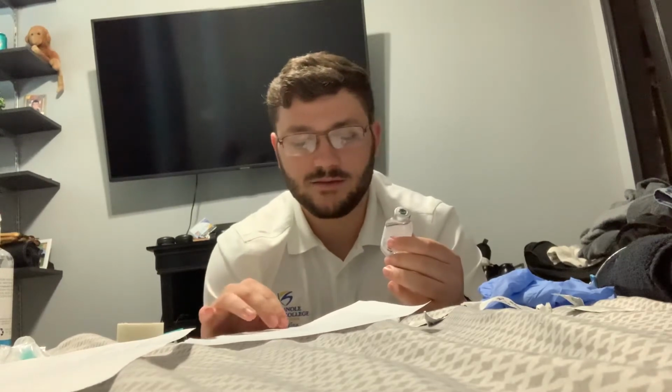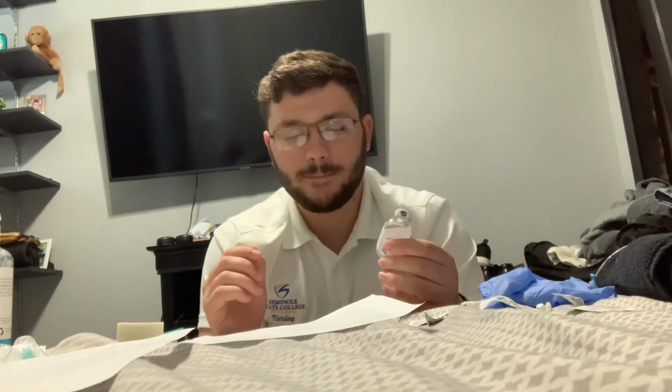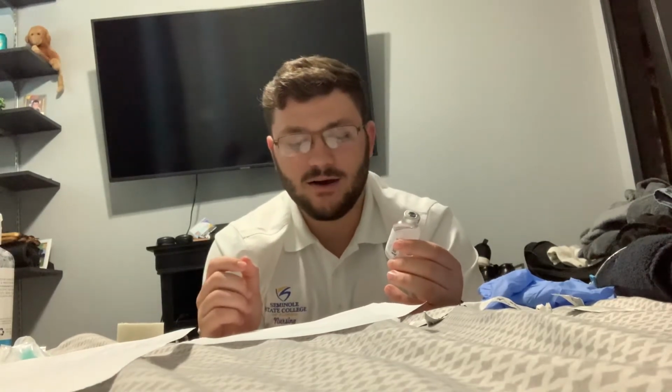Right. So I have my medication. Pull it. All right. So we have the flu vaccine for Anna Pawlowski. It is not expired. I have 0.5 mLs, which is the dose. I have the IM route. I have the start date, which is 5/11/2020, and it will be administered at 14:58. So that would be my second check. Okay. So in doing that, I'm going to gather my supplies. So I have my medication here. I have my syringe. I have a prior label on. I have my syringe. It'll be 2 to 3 mLs.